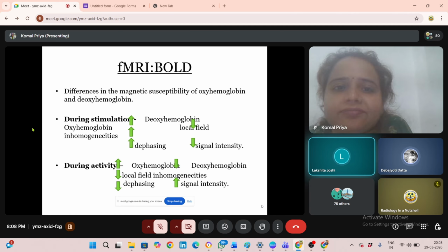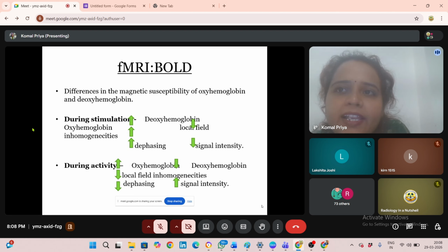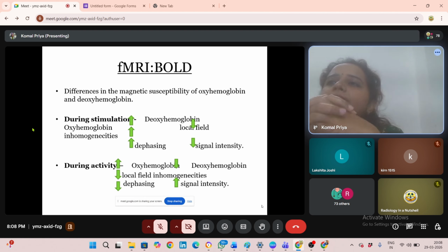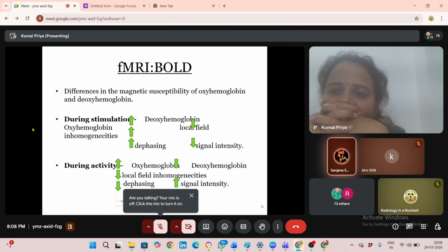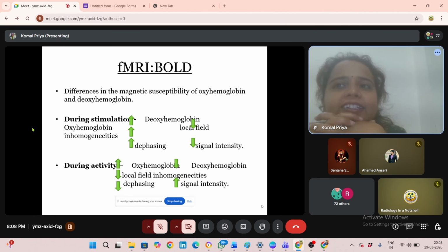It is the time between the 90-degree pulse and the signal received. Anyone else? Ma'am, time from one excitation pulse to the other. Is it the RF excitation pulse? Is it TE? Ma'am, the time between the 90-degree excitation pulse and the echo generated. Yes, it is called TE, time of echo or time to echo.